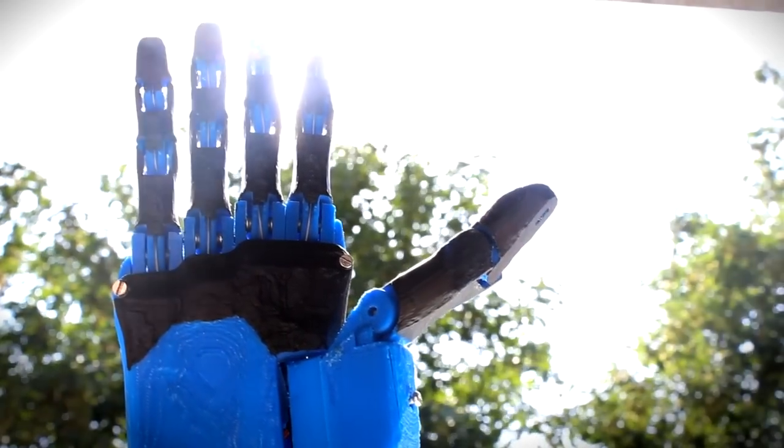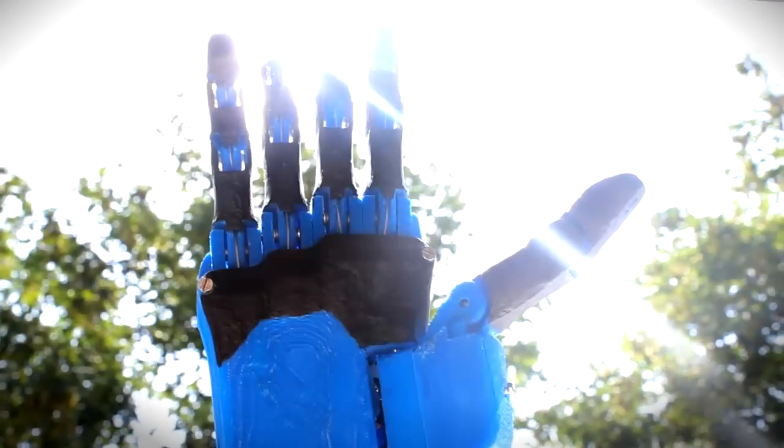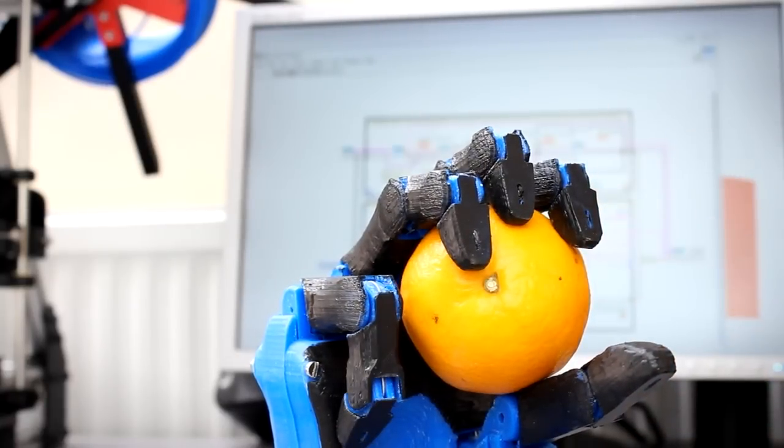The aim of The Open Hand Project is to make robotic prosthetic hands more accessible to the people that need them. At the moment these devices do exist, but they can cost up to $100,000 and they're not usually covered by national health services or health insurance policies.